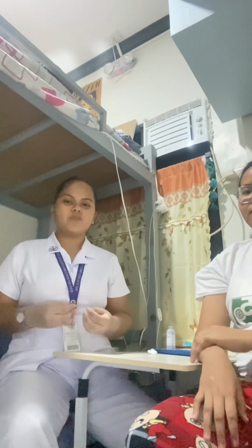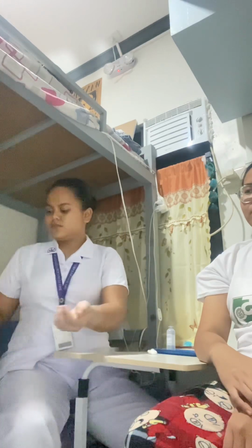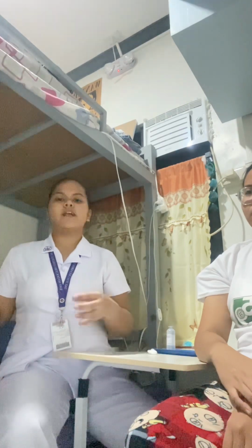So now I'm going to perform an intramuscular injection. So first, what I'm going to do is perform hand hygiene and observe other appropriate infection prevention. And then I'm going to provide the client's privacy by closing the door and drawing the curtains. And I'm going to introduce myself and verify the client's identity.